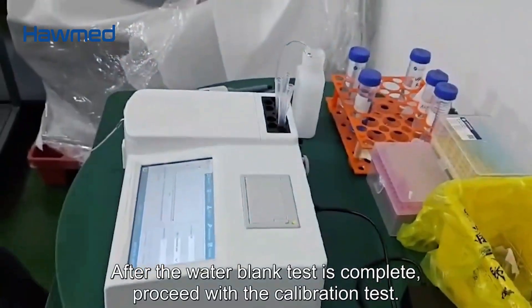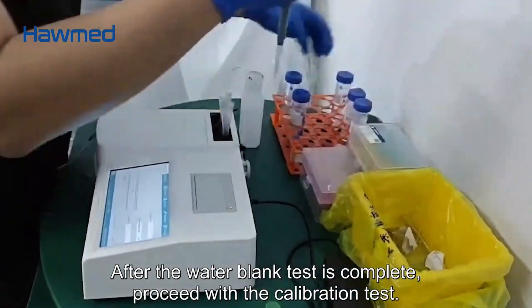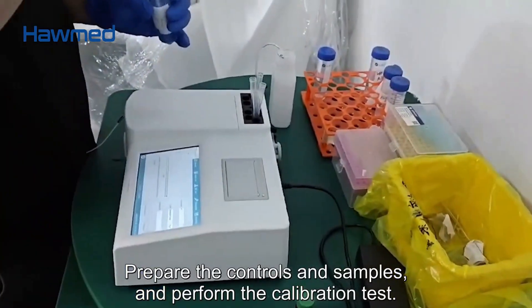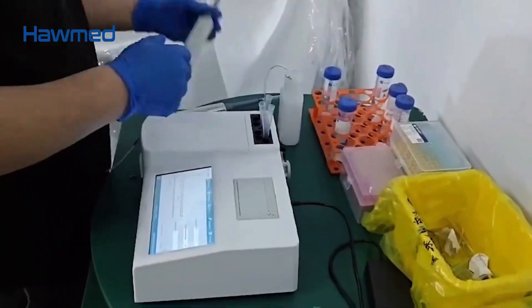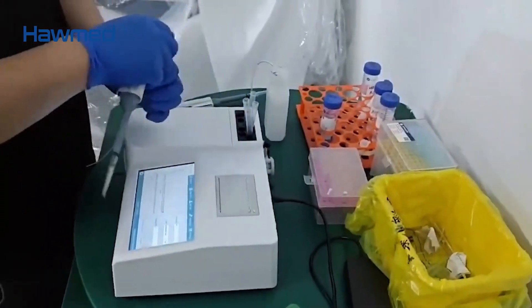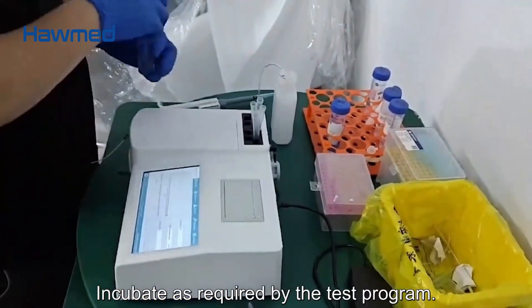After the water blank test is complete, proceed with the calibration test. Prepare the controls and samples, perform the calibration test, and incubate as required by the test program.